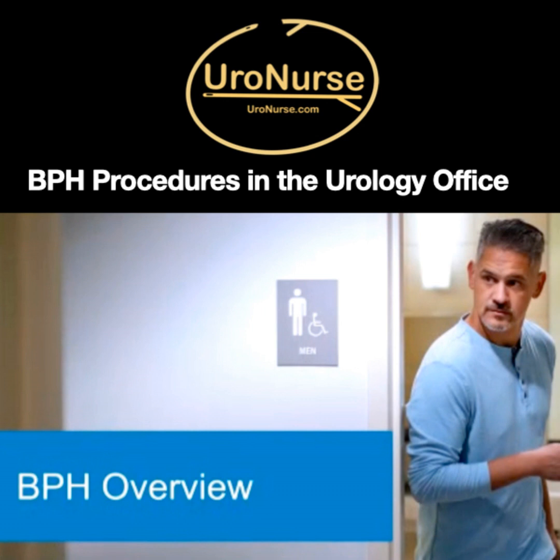Okay. I think that with Rezum, I gave the expectations to my patients that Urolift or Rezum, either one, are going to have very bad irritative symptoms. But with the Urolift, many times, the patient went home without a catheter. With Rezum, it seemed like they just kept going into retention. We'd take it out after a few days, they'd go back into retention. It would go on for weeks. I didn't care for it.